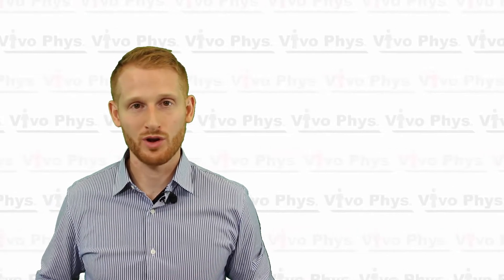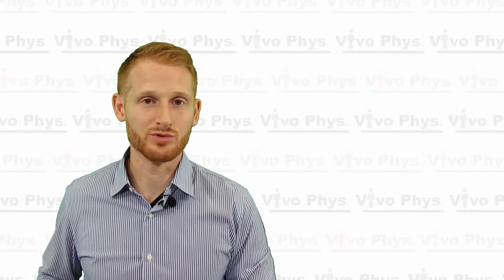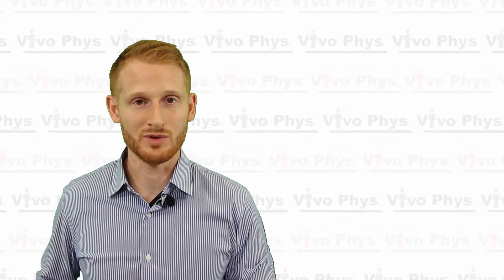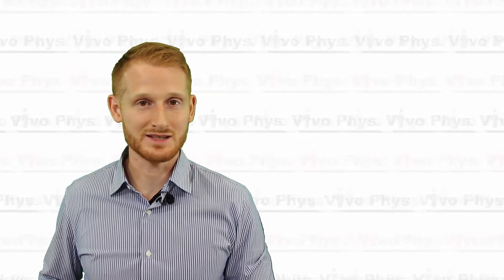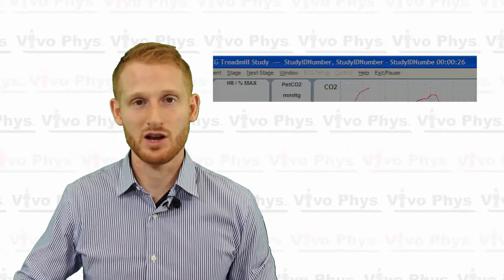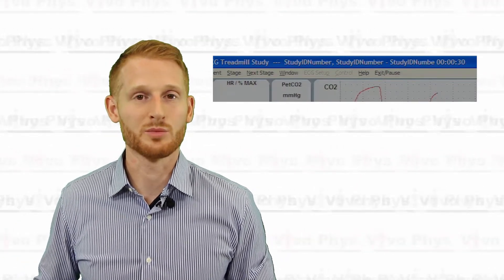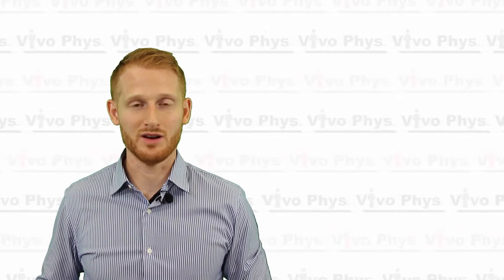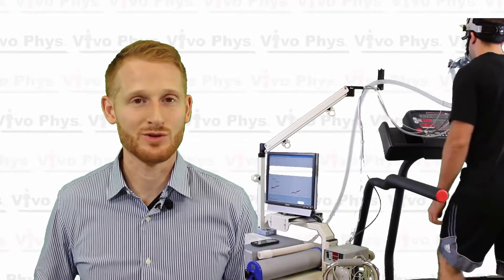From that point forward, whatever protocol you're doing—here we're going to be doing the Bruce protocol, which is the most common treadmill test in the United States—just do your protocol. You can put comments as you go if you click across the top drop-down menu options. One of those will bring up a comment menu if there's anything in the test you want to make note of.